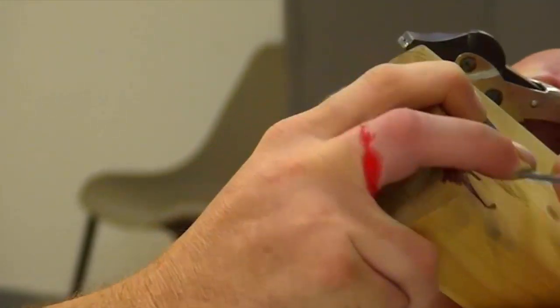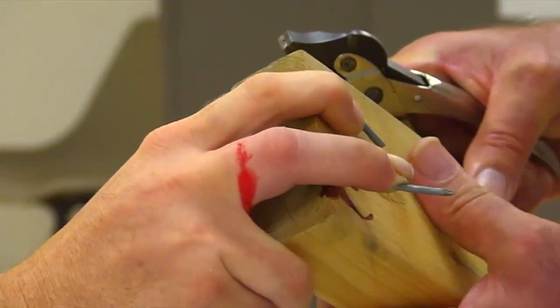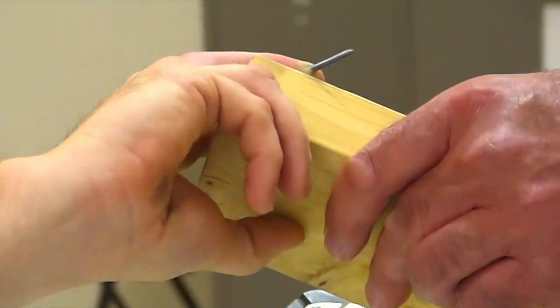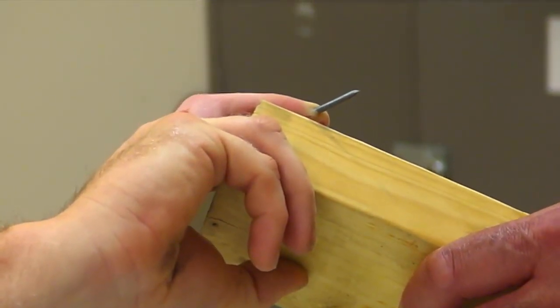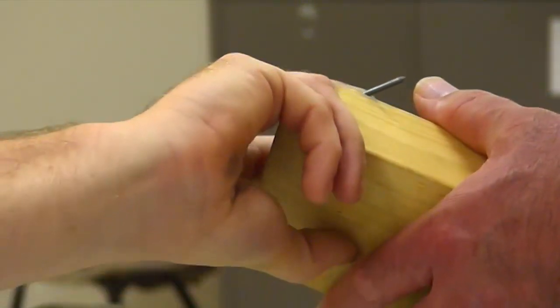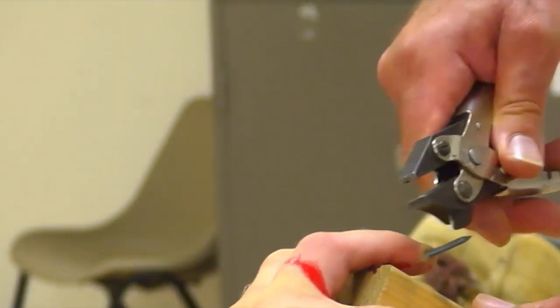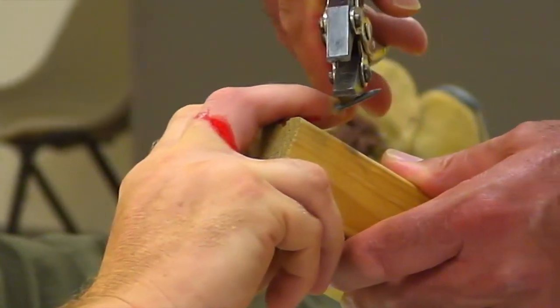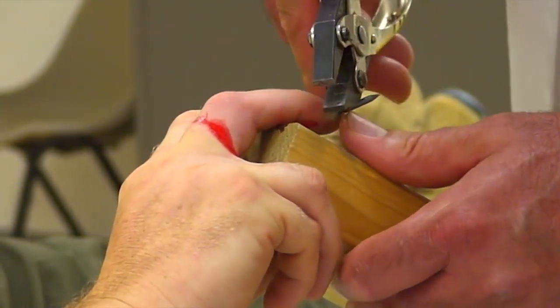I'll just have a look to see if I can cut it underneath. Is there any advantage to that, Ian, or if I get behind it — does it really not matter? It doesn't really matter because it's nothing more sophisticated than just pulling it back through. Just stay as close to the skin as you can, that's all.